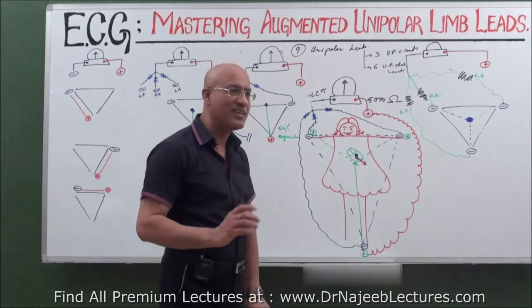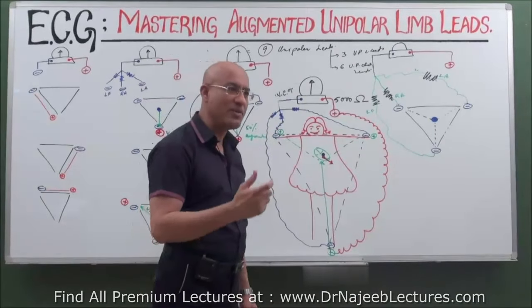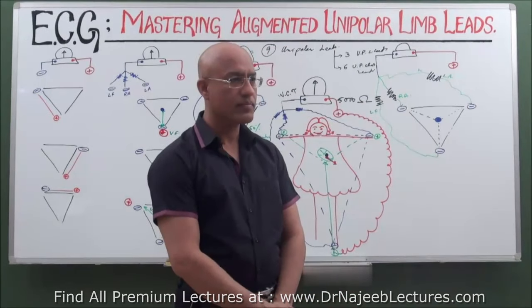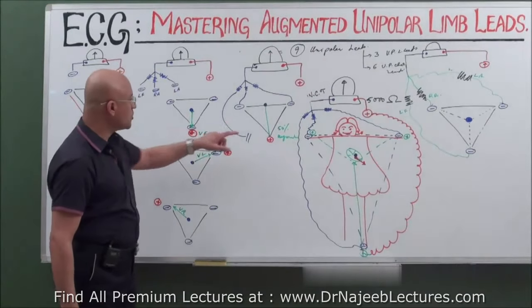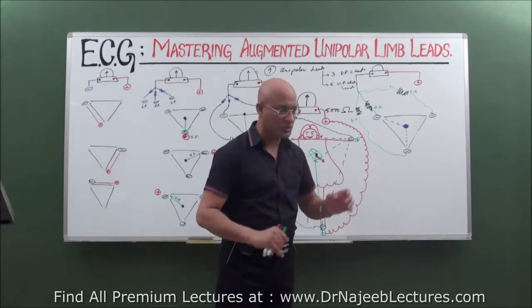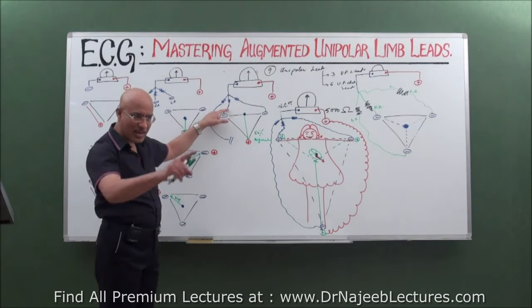Right? So what Goldberger did? Augmented, amplified the voltage, magnified the voltage to VF. He put the magnifying glass. Right? So view is really better. Yes. Yeah, this does change a little zero potential. Zero potential, he say that if negative is removed from one point and left only at two point, then it will be truly zero. That is why from the very beginning I'm saying indifferent electrode is near zero or close to zero. There was a reason what I was saying. But still, it will be very less because resistances are there. You are understanding? Yes. Am I clear?